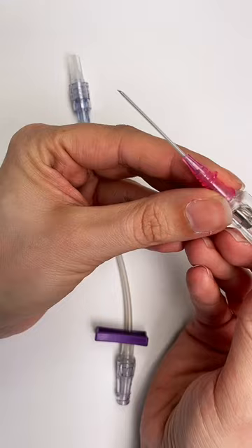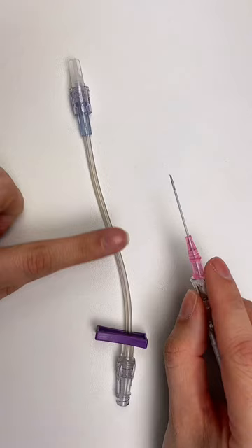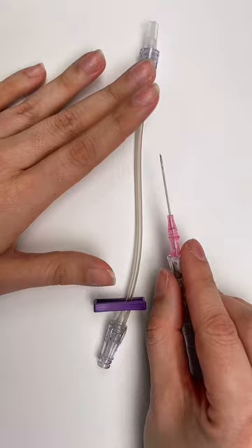The more of the catheter that is inside of the vein, the better that IV is going to be, and the longer it's going to last with things like shearing forces as your patient moves their arm.